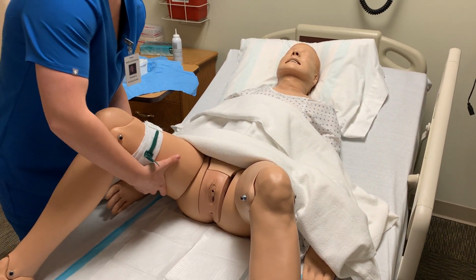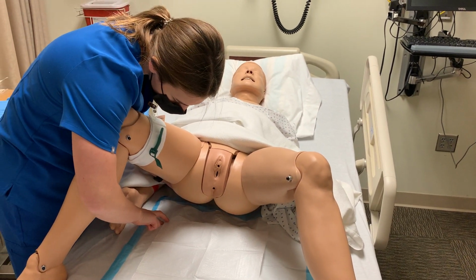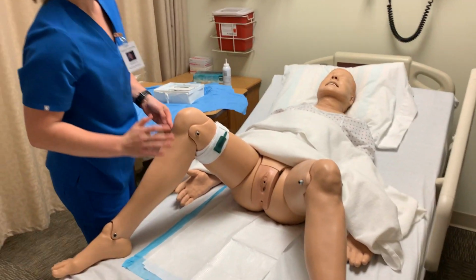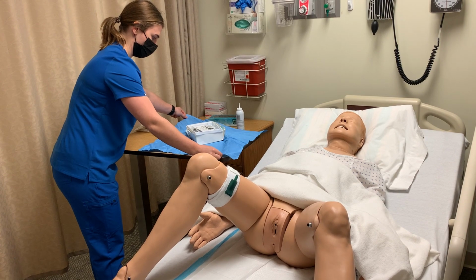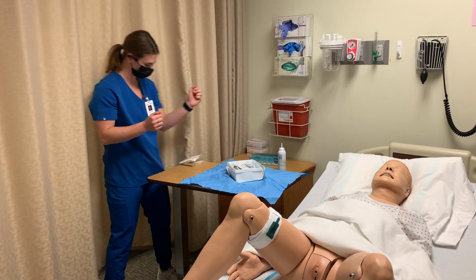Okay, can you go ahead and lift your hips for me? Yep. Okay, now we're going to go ahead and adjust this and get our gloves on.